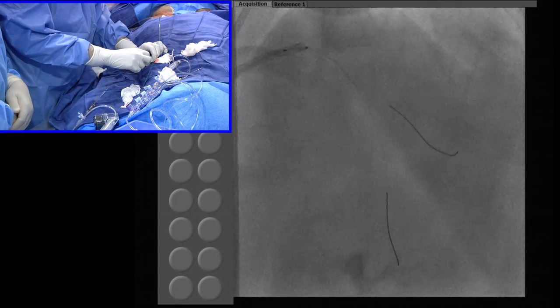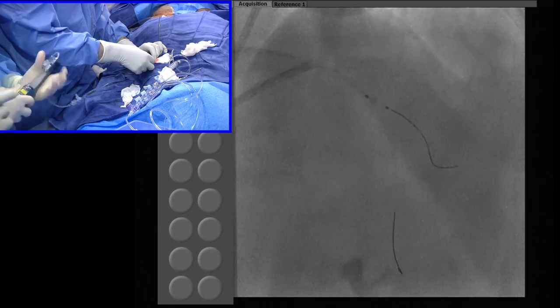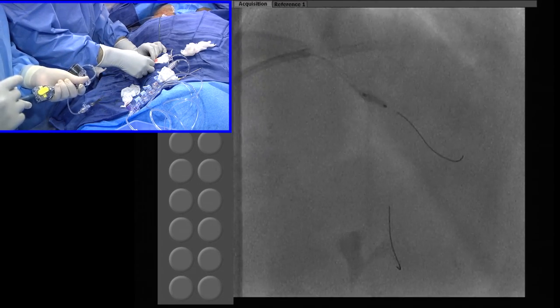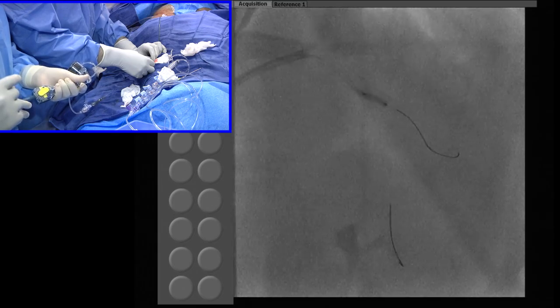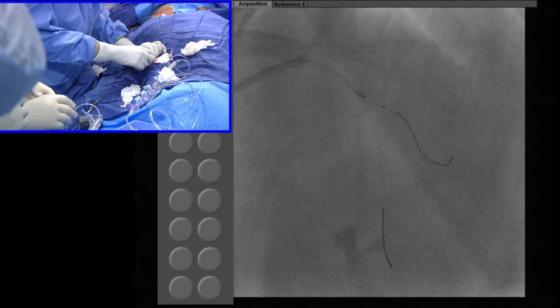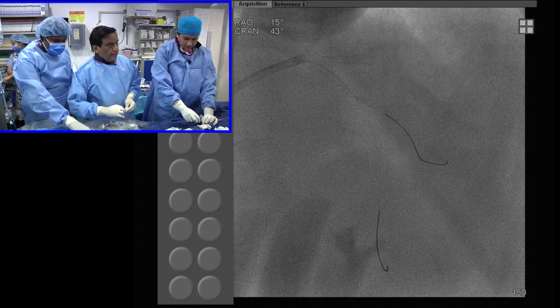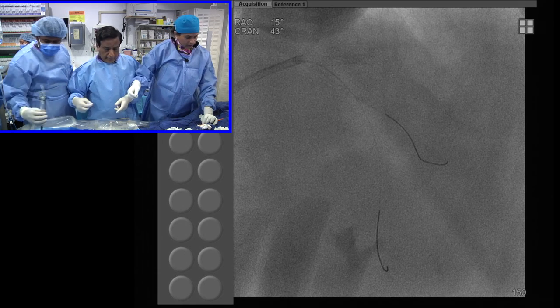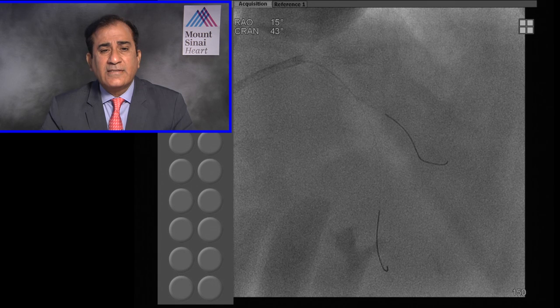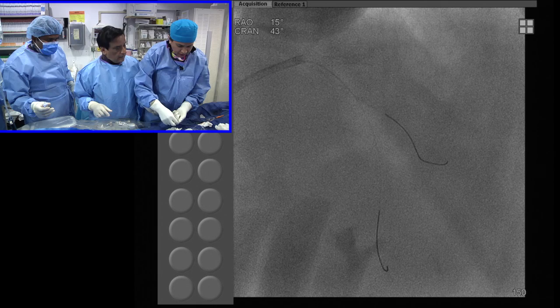Okay. Get us a 24 Promus now. That was a 2.5, no? Yes. Go up again. Good. We have to tell her to put her hands to the side. After her previous stent to the circumflex, to the Ramus, what dual antiplatelets? Plavix, aspirin. Okay.